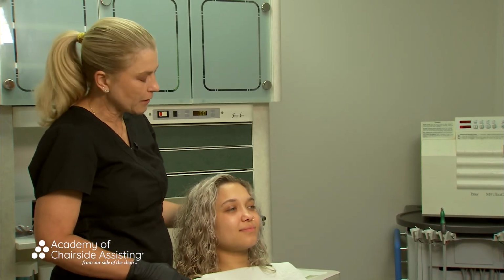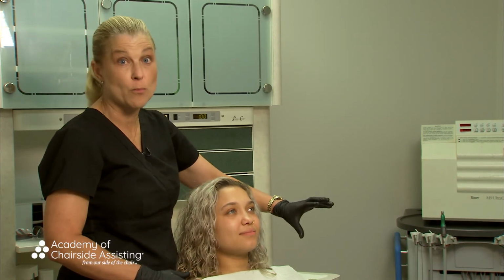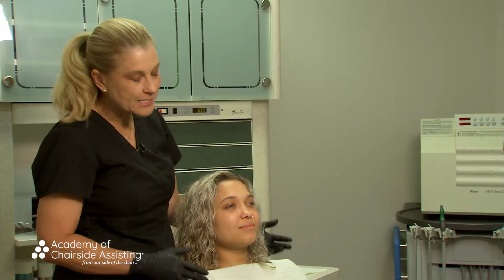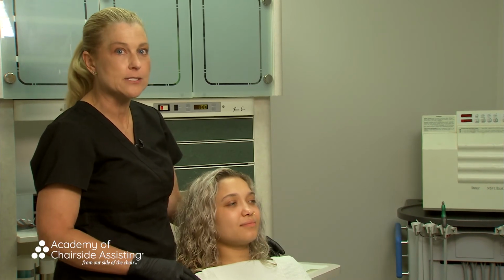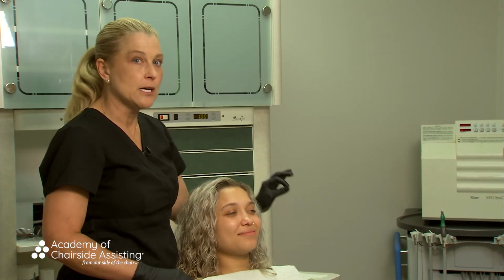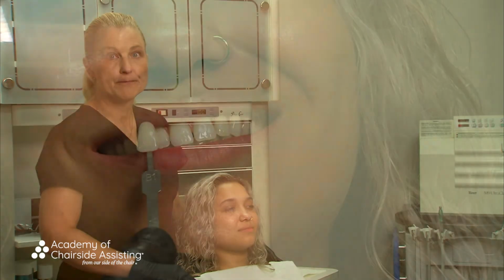But it is really important because if she does not continue this whitening process and wear the next tray tomorrow, it's going to relapse. And we want to do every single day for 7 days. But I can guarantee that if we already see this kind of result in 20 minutes, just think about what Haley's going to get in 7 days. And so that's super easy for you to do, right? 20 minutes a day, again, not skipping a day. Those words are very, very important to make sure that we have that compliance from patients.